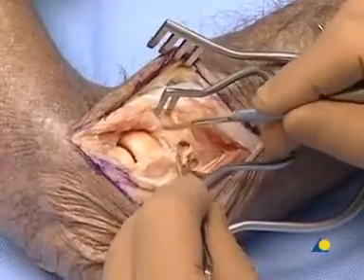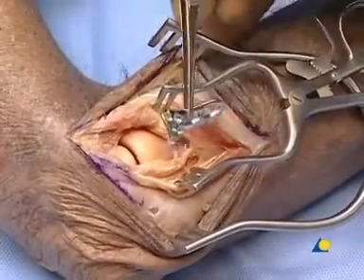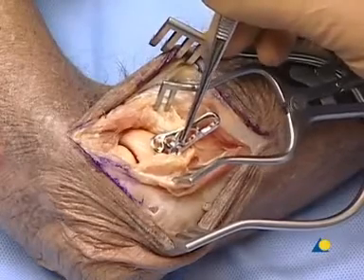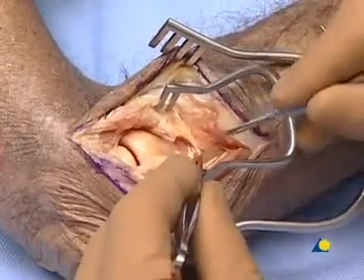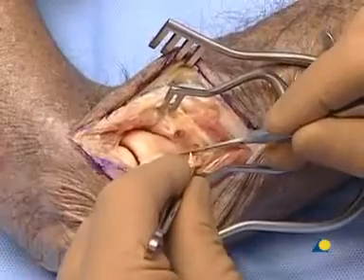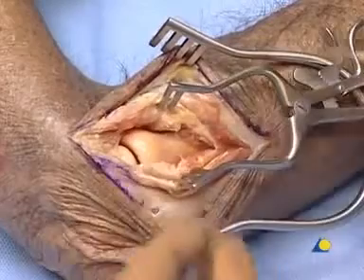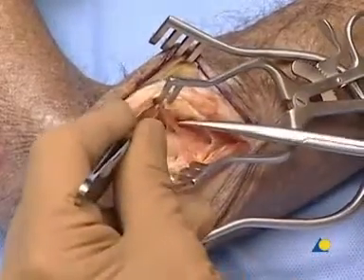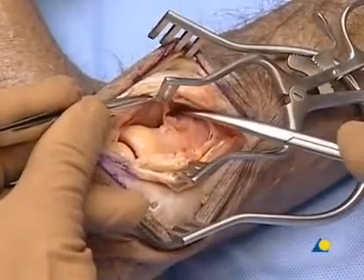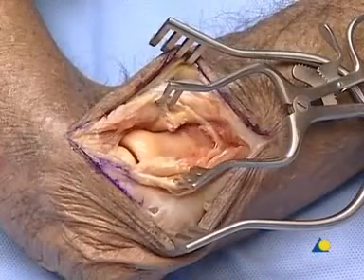These are the fibers of the supinator. With a two-hole plate or screws in the radial head, it is not necessary to locate the nerve, as this plate is quite short and impingement on the posterior interosseous nerve can be avoided. The extensor muscles are incised, revealing the supinator, which is incised in the posterior aspect with the forearm pronated. This incision should provide enough exposure. If it is necessary to locate the posterior interosseous nerve, it is found here, in the leading edge of the supinator muscle. With this exposure, the head can be fixed or a small radial head plate can be inserted.